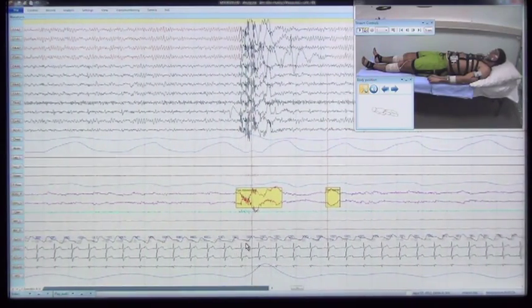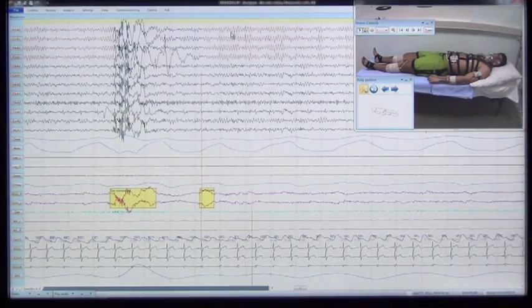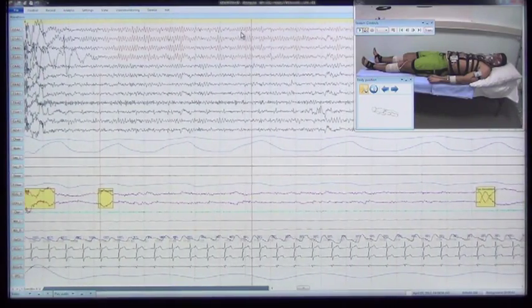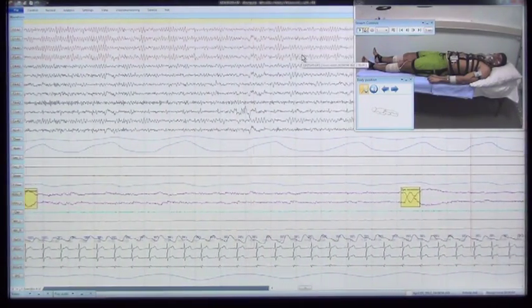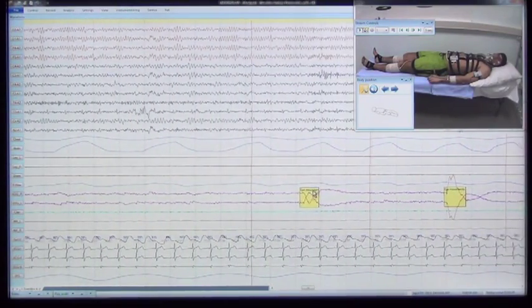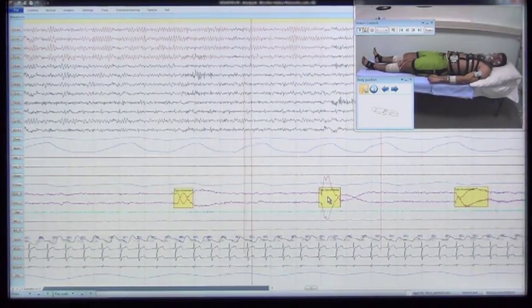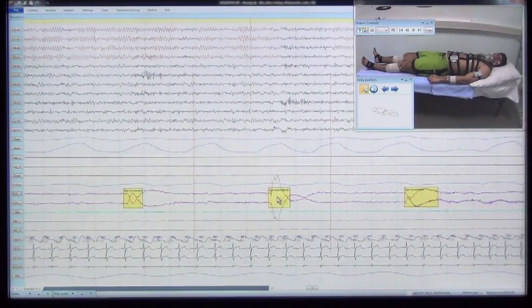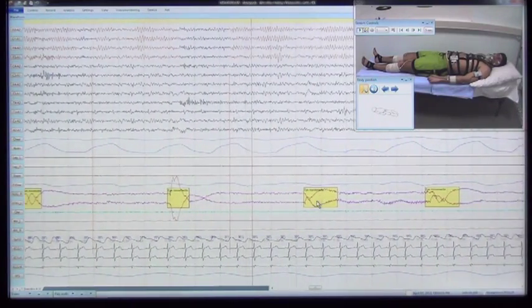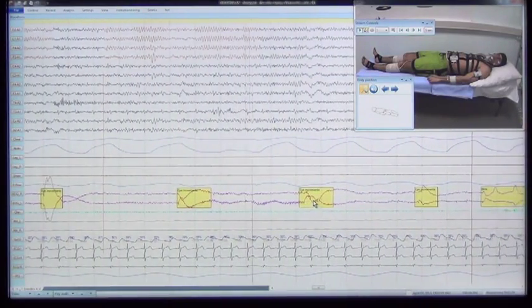The patient turns his head to the left and closes his eyes. Alpha activity in the occipital-parietal area is dominating. Eyeball movements are visible when the eyes are closed: to the left, to the left, to the right, up, down, look straight.